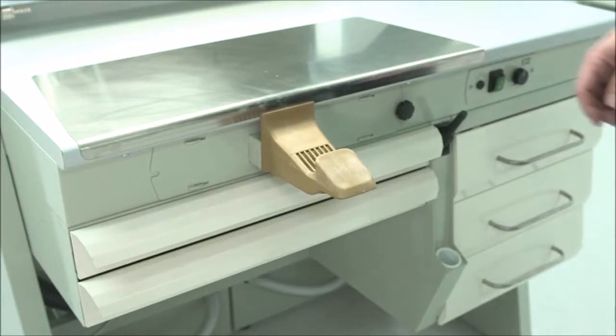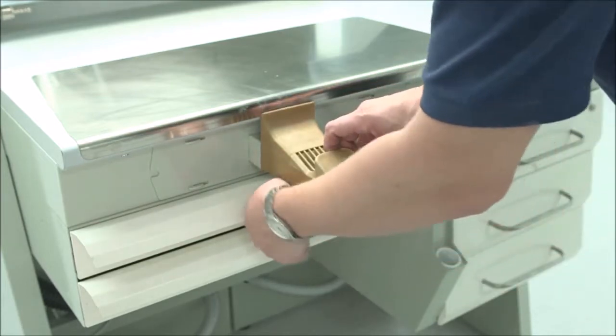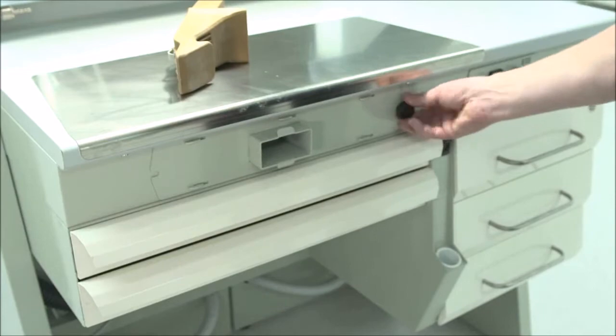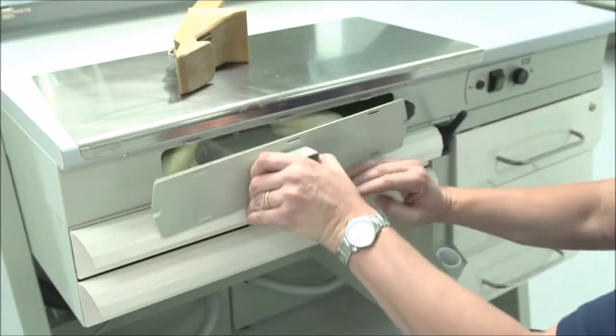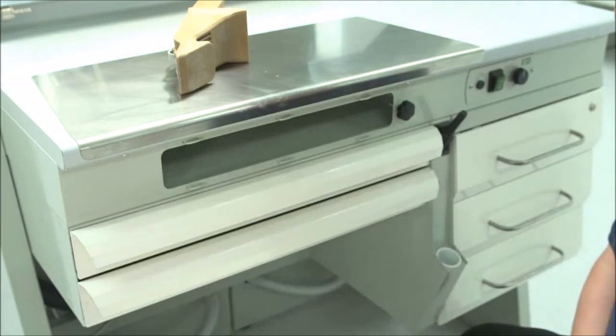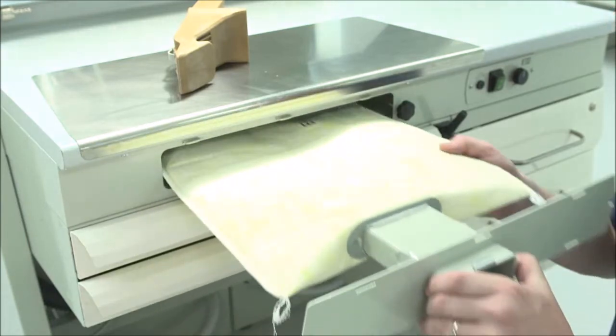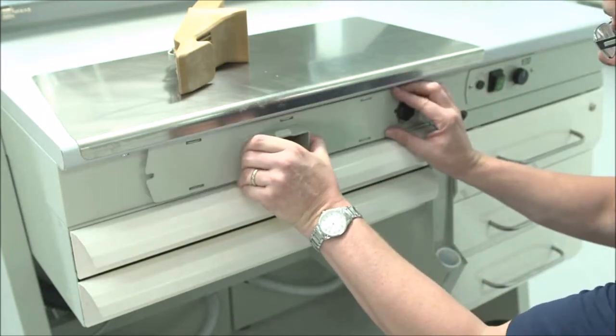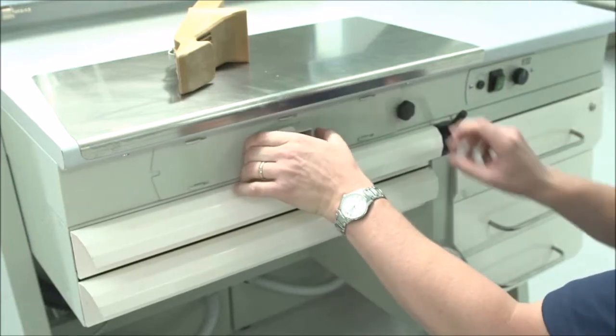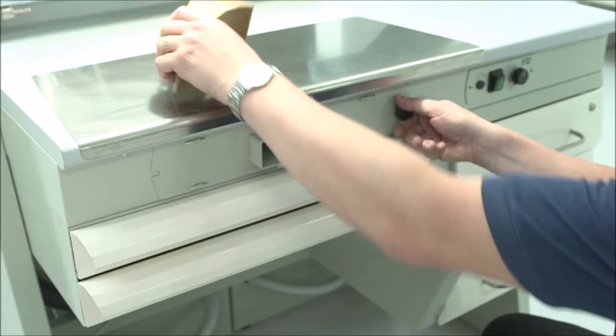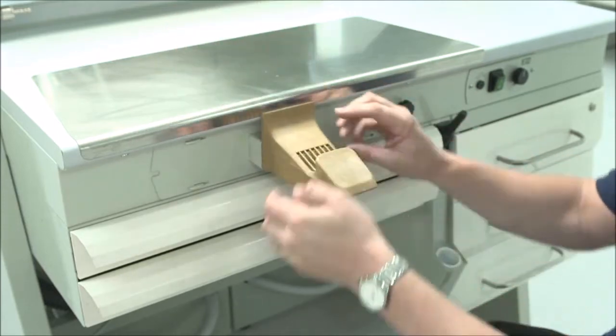To replace the filter, firstly release the bench peg, loosen the black knob to the right, push the whole panel to the left and bring forward. To replace, push the filter back in, push to the right, tighten and replace the peg.